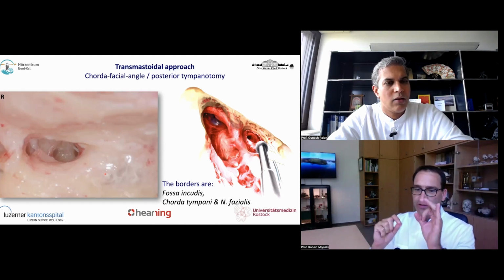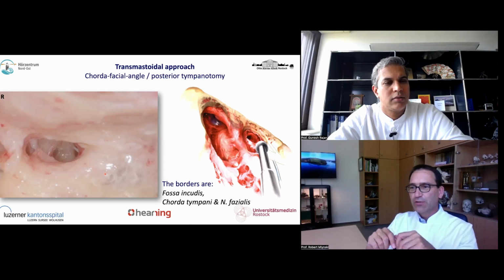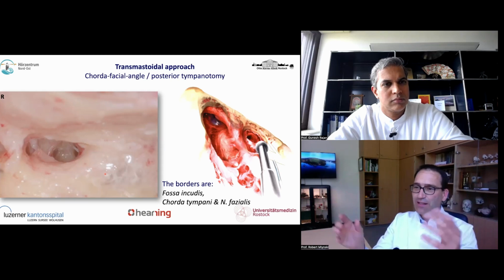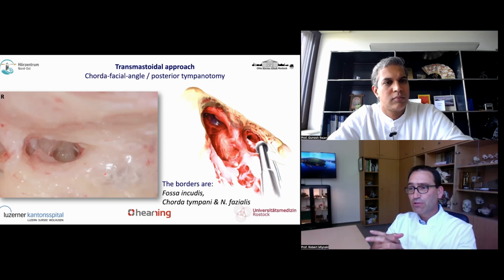I mean, if you have only a spot-like aperture, you have lots of depth of focus, but you don't have any light there. It is being bent and it's being diffused, so you need light there. This is very important, especially if you grow older and your lenses get blurred, you know.